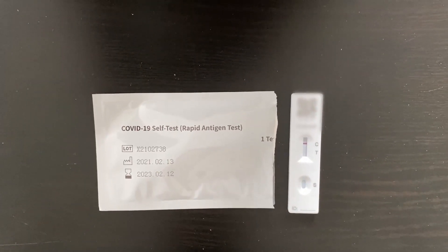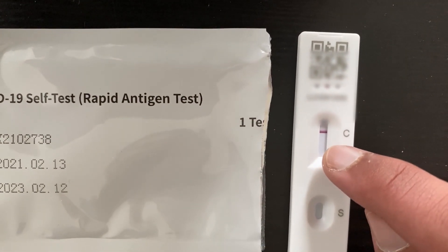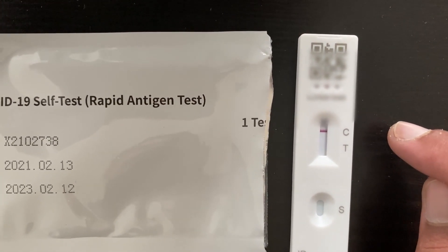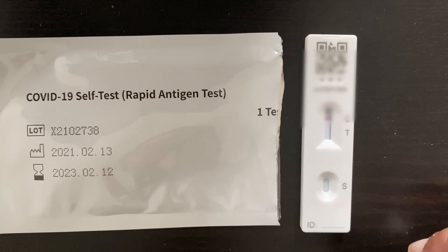So 30 minutes has passed by and as you can see, this is my result. C stands for control, so everyone should get a line on C, as you can see there. T is for the test result. If you get a line on just C, then you're negative. If you get a line on C and T, then you're positive. Anything else is a void result.